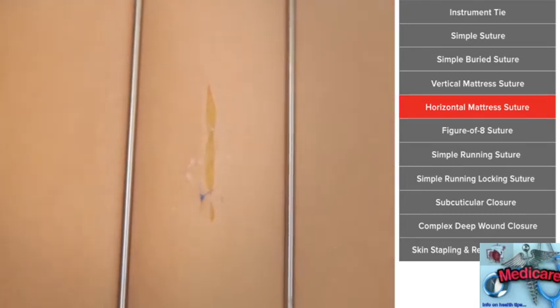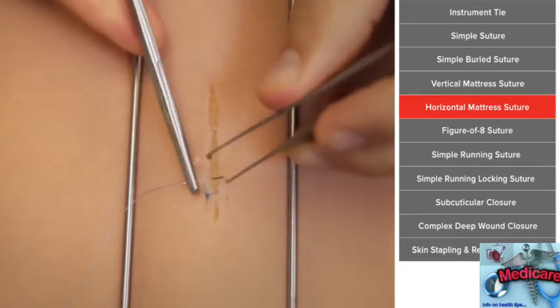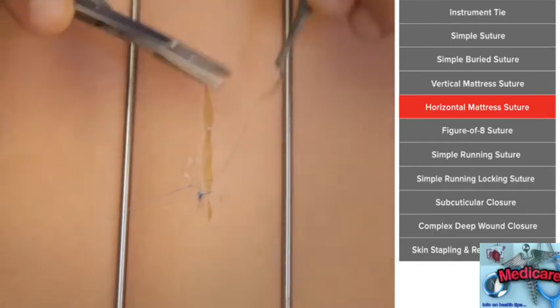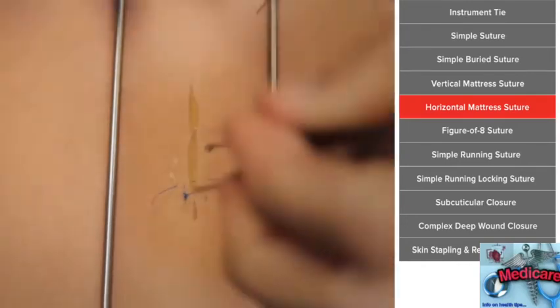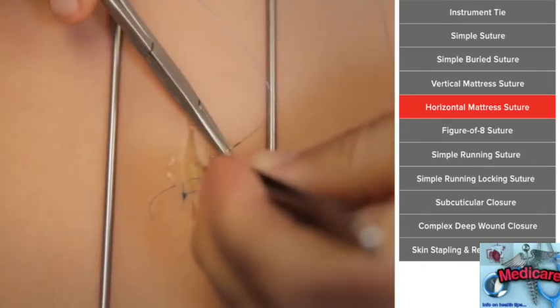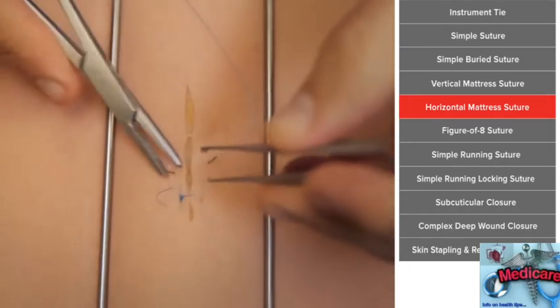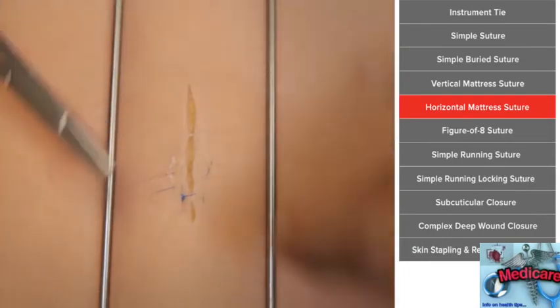Vertical is nicer because it does evert the skin edges, but in a case like this where eversion is not a problem, simply doing a horizontal mattress will help you. And sometimes in cosmetic surgery, we don't want any suture marks on one side. And when you come to the second side here, what you would do is take the first half of your simple and then just take simply a dermal bite on the opposite side and then come back and come through the skin again. And when you tie it down, it'll simply pull the dermis toward it.